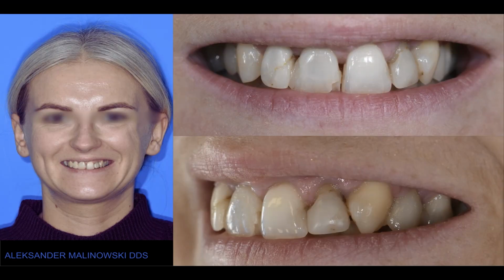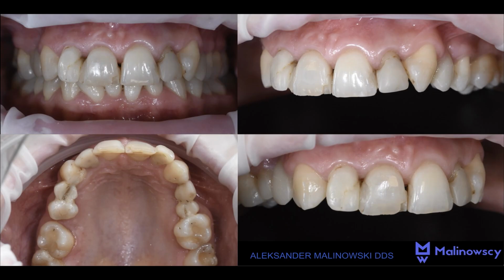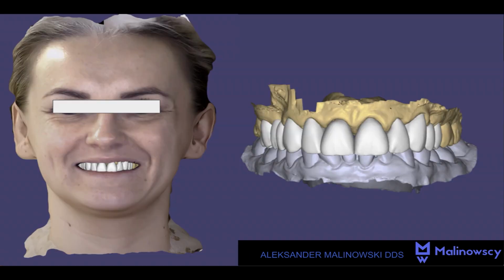Here we can see the poor aesthetics. And I will show you something that has completely changed my method. I thought that I knew everything about the facial scanner, but months ago, I made something different. This is the condition of the teeth, and we made the design.